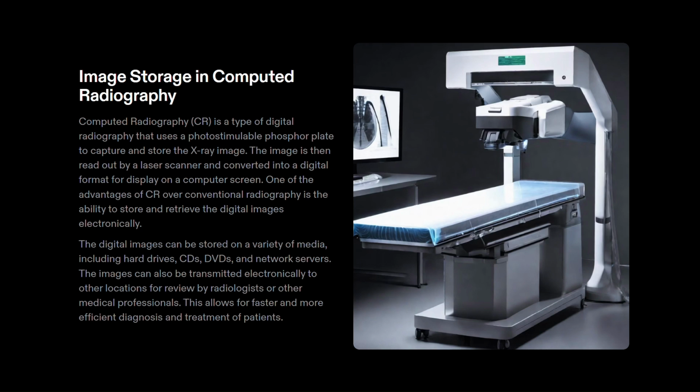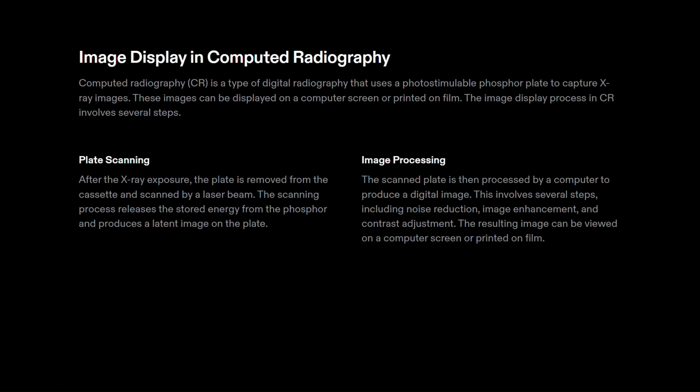They can be stored on a variety of media like CDs, DVDs, network servers, and hard drives. The images can also be transmitted electronically to various locations for review by radiologists and other medical professionals. This allows for faster and more efficient diagnosis and treatment of patients.